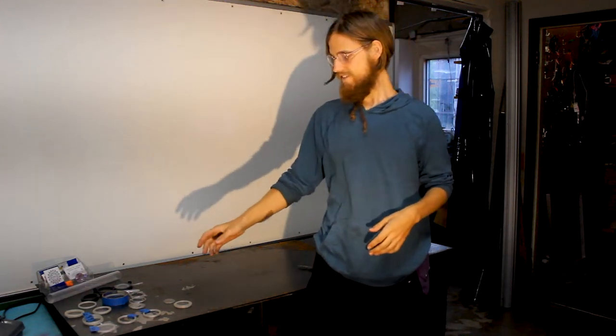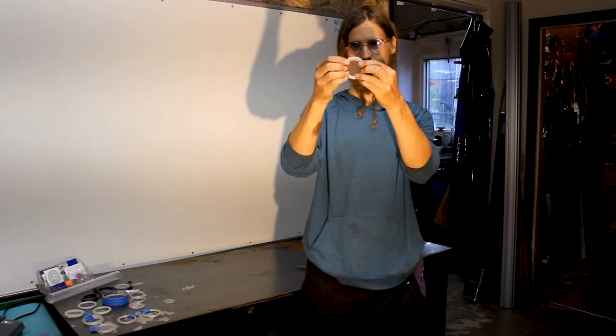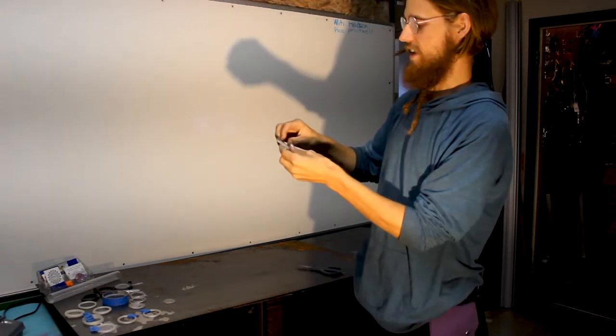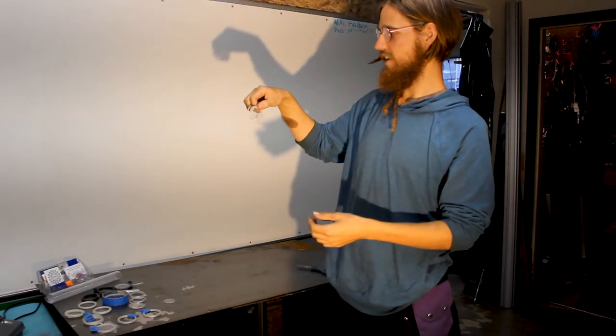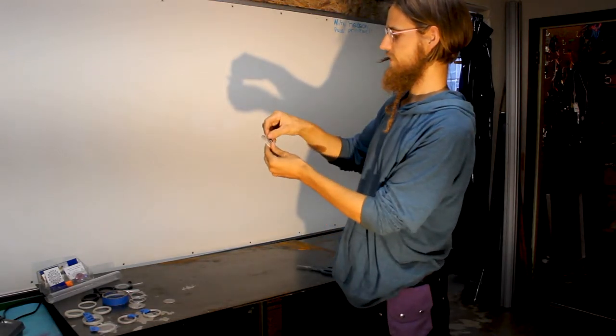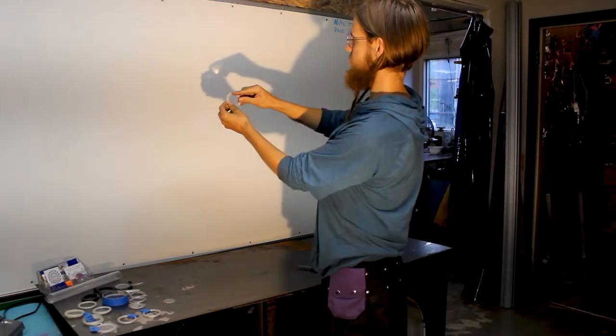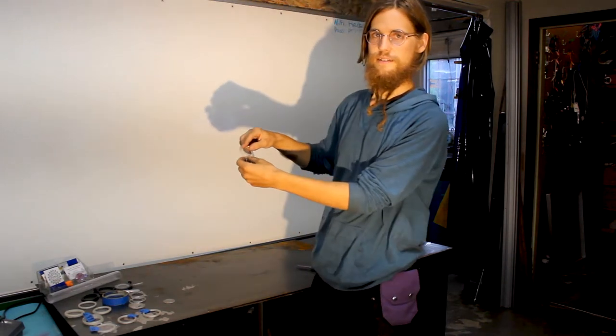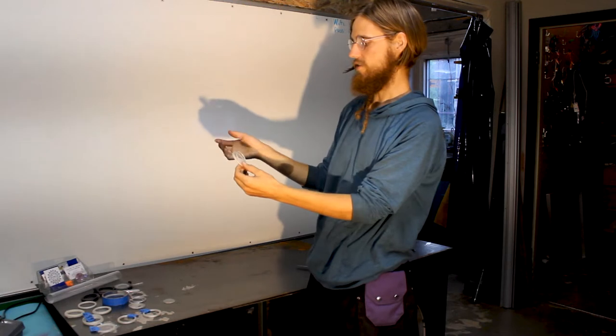Hello! I'm gonna show you some prototypes I've been working on. I'm really excited. I just finished this first lens that is actually not leaking. I've done a bunch that are leaking. But this one's great! This is like the first lens that makes me think that this could viably be a pair of glasses you could 3D print.